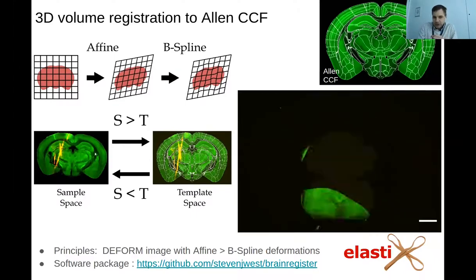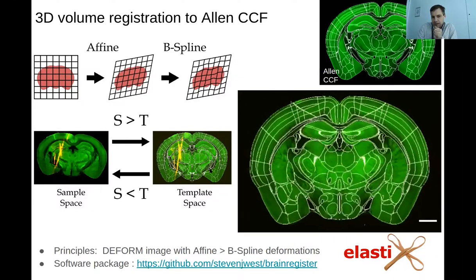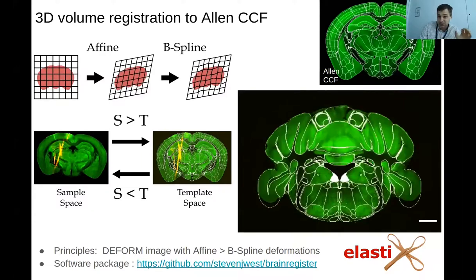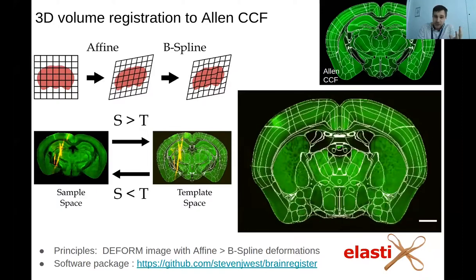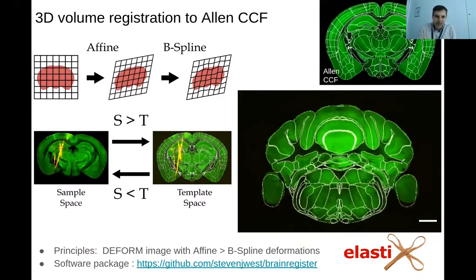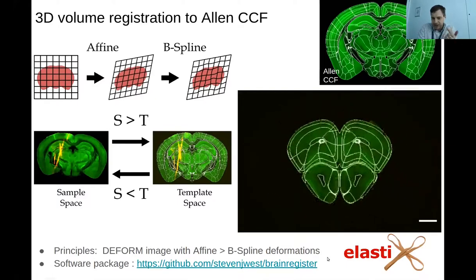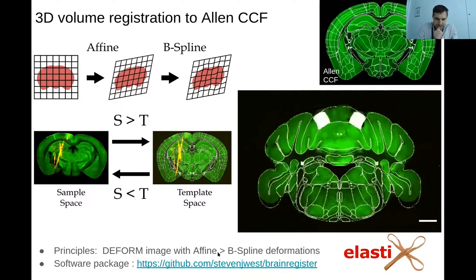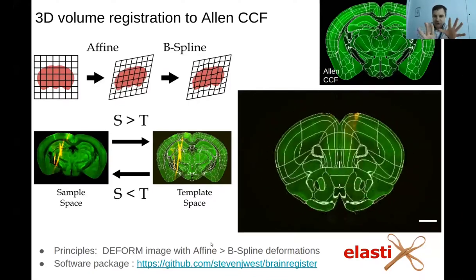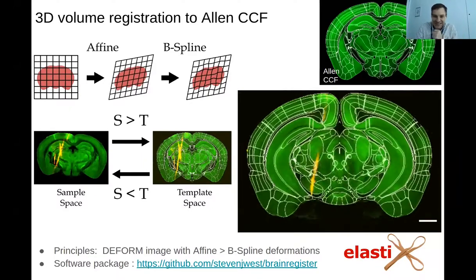When I perform this registration, I normally do it in both directions — this is mainly to check the quality of the transform in an automated way. It also allows you to overlay the atlas onto your original histology, which is useful if you're doing things like reconstructing cells where you might not want to deform your original histology. This whole pipeline has been put into a software package — I'll put the link in the chat. It's still a work in progress, but essentially it's just running one command and the Elastix framework takes care of a lot of the complex mathematics underlying it for you.